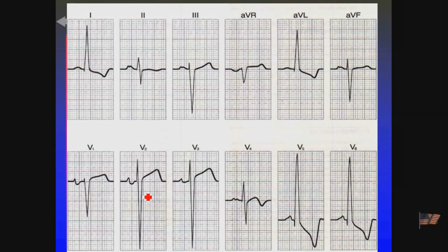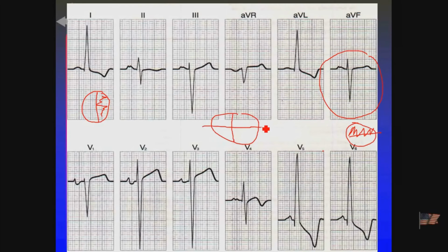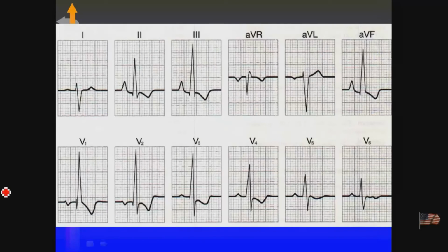So what do we got here, guys? Where's the axis deviation? Right? It's actually up and to the left. So that would be if I merge those two. Left axis deviation. Nope. I can draw really well, can't I? So it's going to the right, and it's going down.